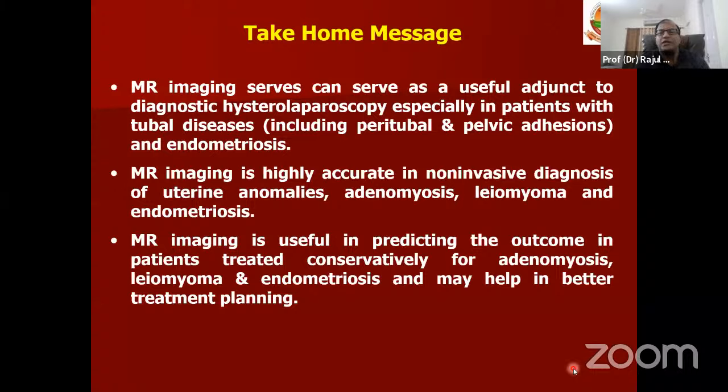MR imaging is highly accurate in non-invasive diagnosis of uterine anomalies, adenomyosis, leiomyoma, and endometriosis. MR imaging is useful in predicting the outcome of patients who are being treated conservatively for adenomyosis, leiomyoma, and endometriosis, and may help in better treatment planning.